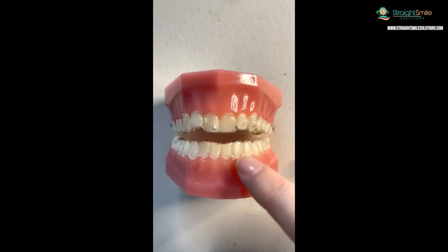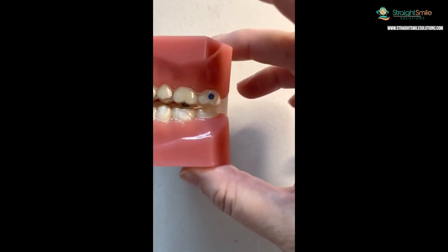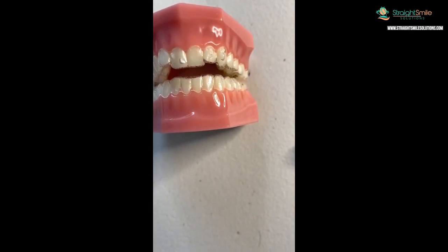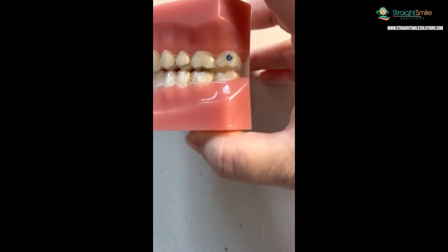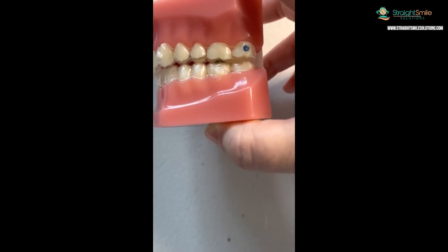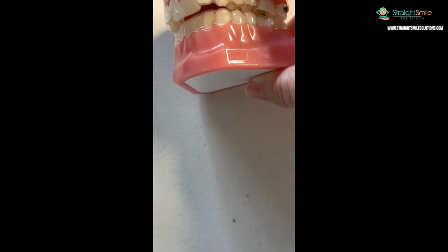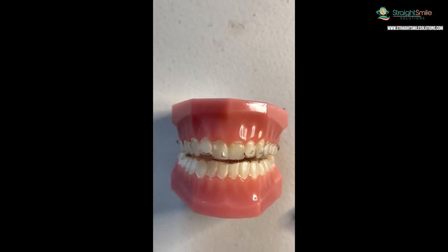Compliance indicators - it used to be free on Invisalign Teen and was kind of a gimmick. Now it's a $35 add-on, and I don't see the point. If they wear it 10 hours a day for two weeks it'll still turn colors and look like they wore it - which is not as effective as wearing it 22 hours a day for seven days. I can also just tell by looking at the bite, the teeth, the color, and dinginess of the aligners whether they wore it. It's a waste of money for me.